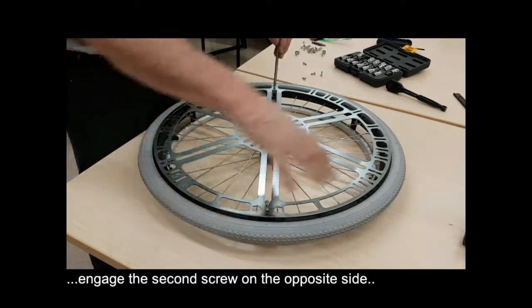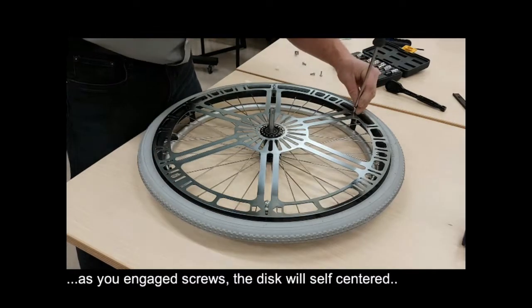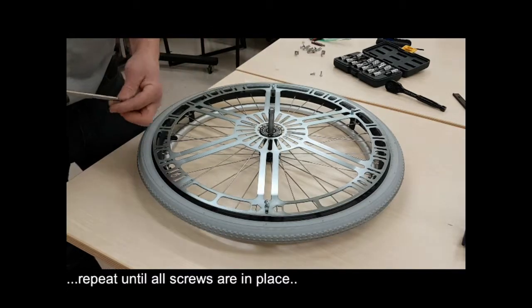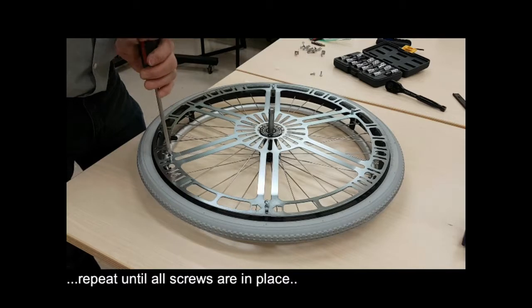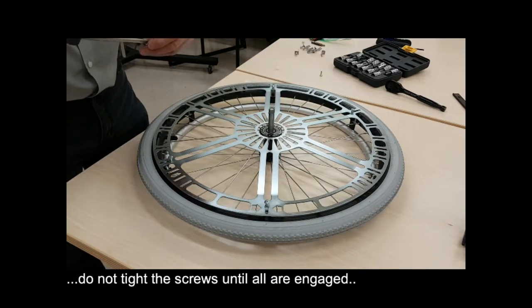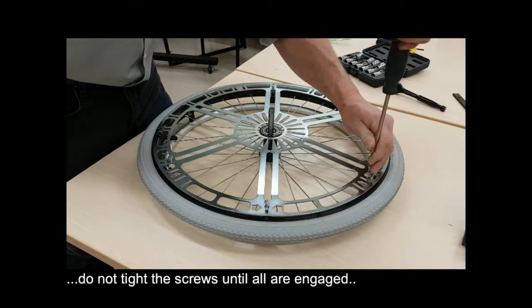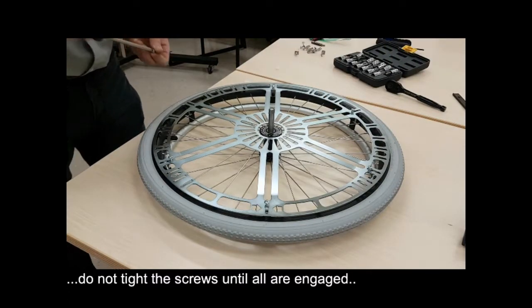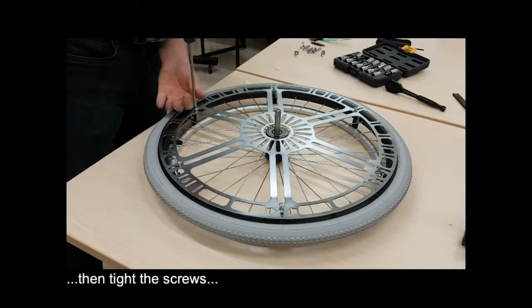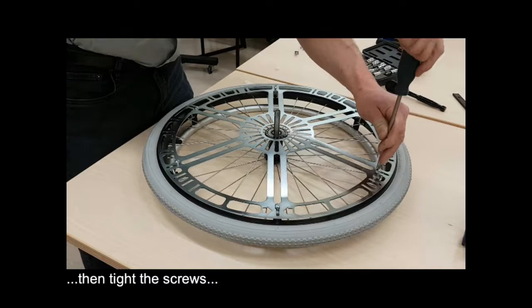Doing that will center the blocking disc with the tire itself, and then we go with the other one and do the opposite. And you don't tighten the screws in place until all the 6, in that case, 6 screws are engaged, and once they are engaged, then you'll be able to tighten the screws without any problem. So we tighten the screws in place. Using a power tool will cut the time by much, and it's not a problem to be using a power tool.